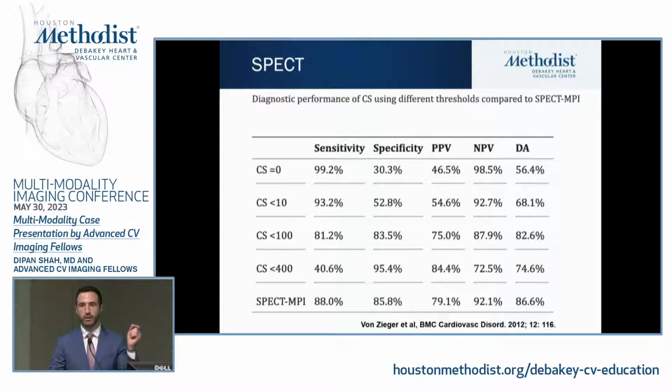So the highest pixel, the hottest pixel, is actually a very cold pixel, and everything else relative to that looks normal, quote unquote. That's why the sensitivity in that case is quite low, because you may be missing a big chunk of those balanced ischemia. But on the other hand, if you do have any kind of perfusion defect in a SPECT with a high calcium score, you can almost be certain that that high calcification burden is actually causing ischemia, and that is obstructive disease too. Did that answer?